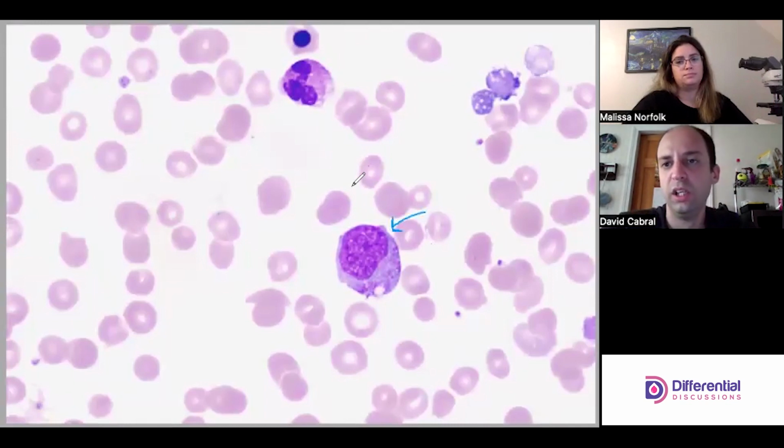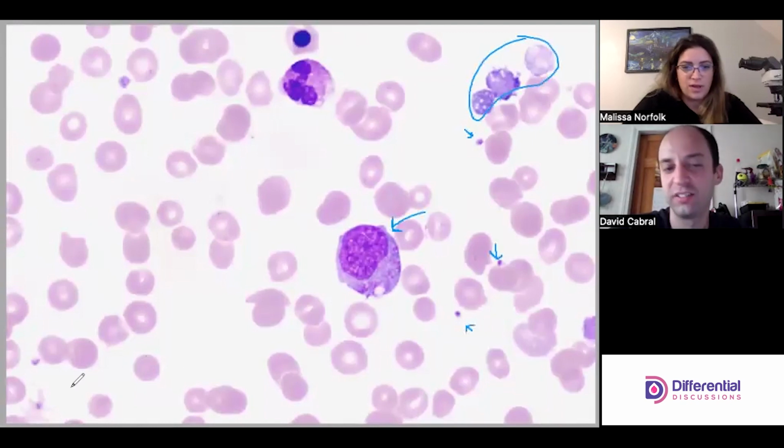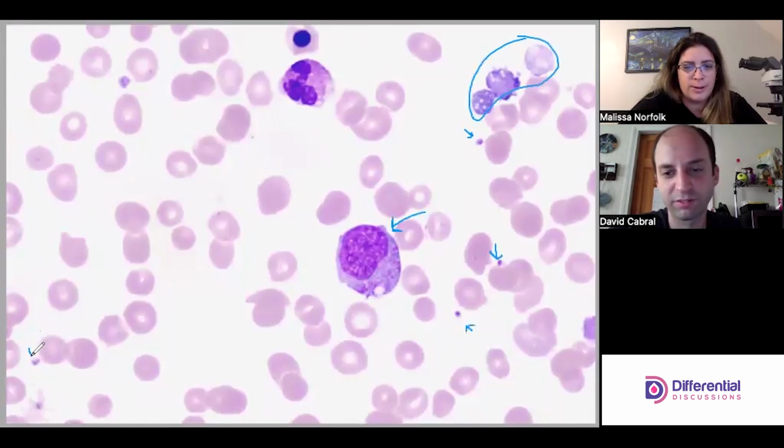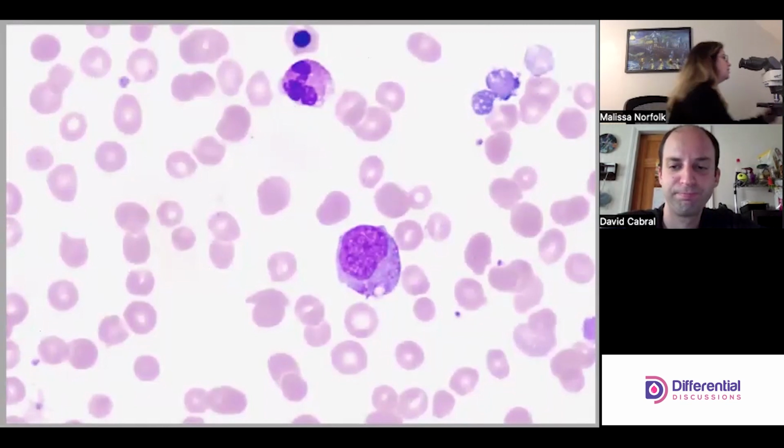And then we have a dark blue platelet up in the corner there. That's one of the darker ones we've seen so far. Oh my gosh, look, we actually have a few normal platelets too. It's good that you point that out, because I don't think we've seen a normal platelet yet, and we have more than a couple. Looks like this one's on top of an acanthocyte. And then some more normals. Crazy, there's normal platelets. And then this looks like a neutrophil. Yeah, I'd go neutrophil. And an NRBC. Pretty cool.